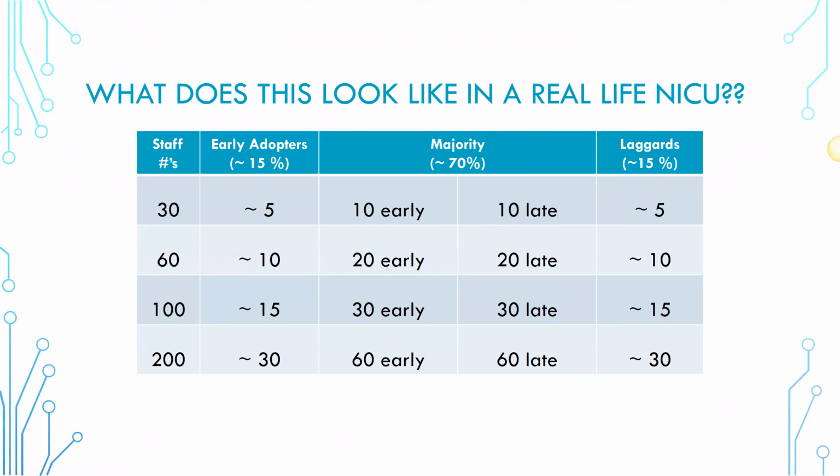Hands-on care as much as possible, especially feeding times. Movement artifact is a little easier to pick up, but padding and burping are a challenge. Changes in ventilation or vital signs are helpful to note as well. But again, it's redundant charting. None of this goes into the EMR.